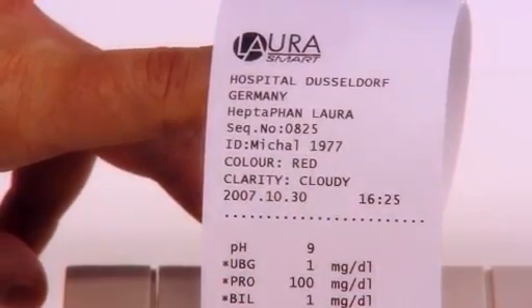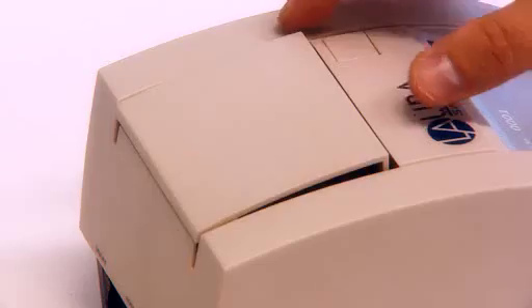The LoRa smart reader comes with an inbuilt thermoprinter as standard, which is very quick and quiet, and it's easy to change the paper.